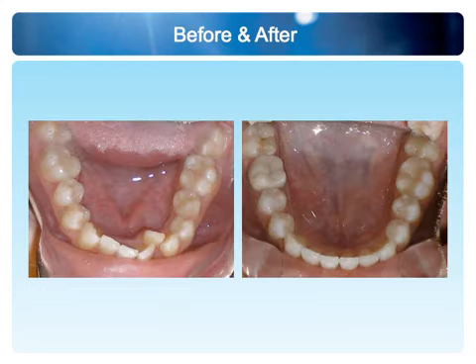And so to have that arch form established on the top, arch form and arch width, it then allows you to develop the buccolingual inclination of the posterior teeth and establish a proper arch form and width on the lower, and all of a sudden, the tooth that really looks like an extraction over here can look like this over there, with no IPR in this case.